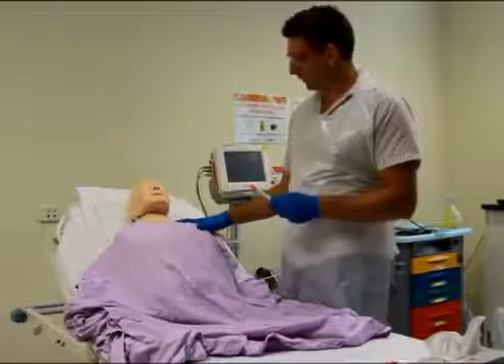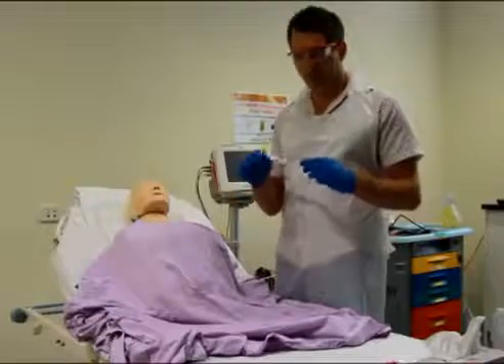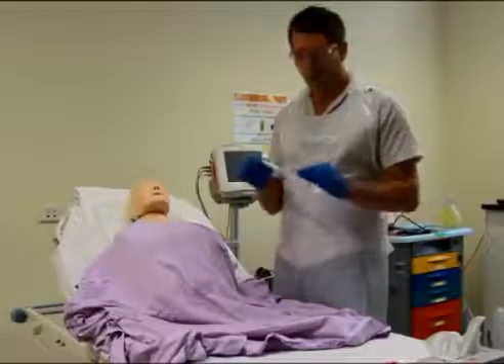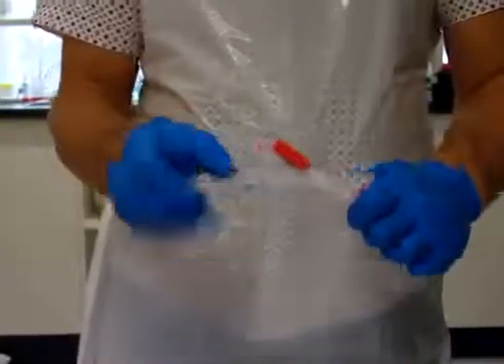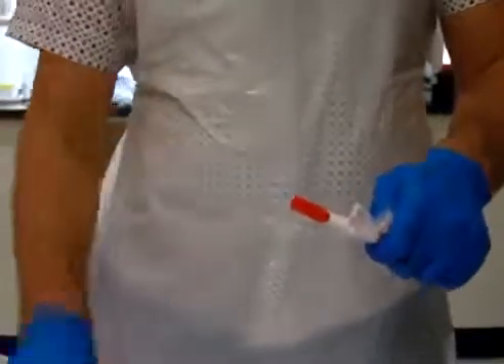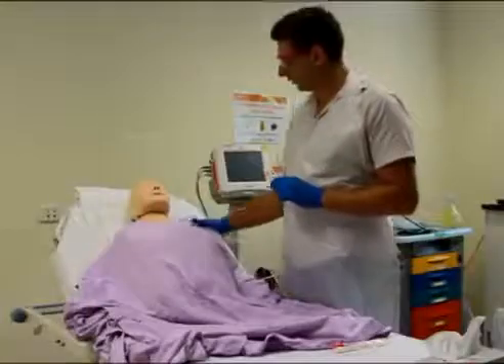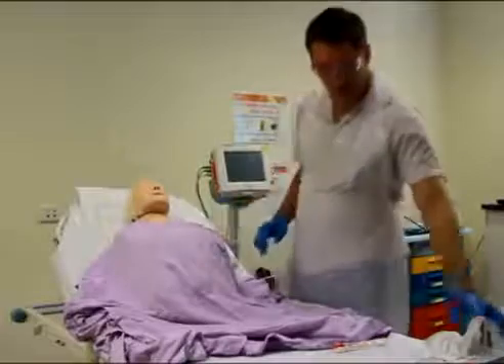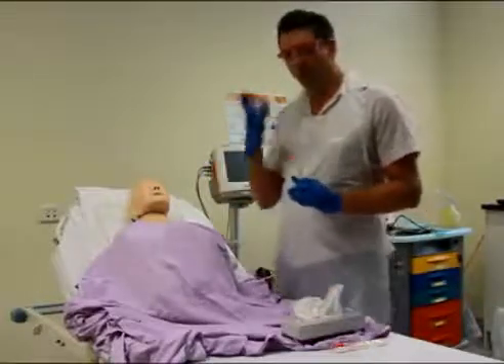I've explained to Roger what we're doing. I've got two types of swabs we can take: a viral swab which has a little brushed end, or a bacterial swab which has a medium in the bottom that you insert the swab into. I've told Roger what we're doing, and I've got tissues ready because he will probably want to sneeze or feel like he's got a runny nose.